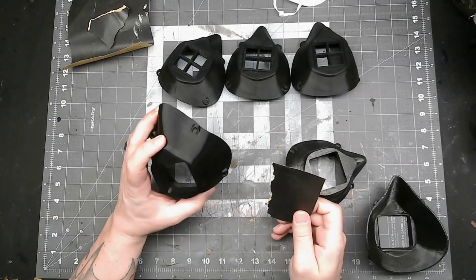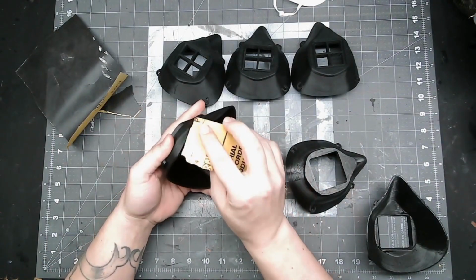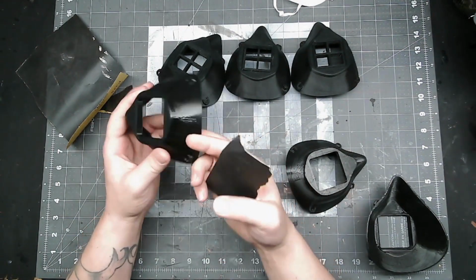So these do require a little bit of cleanup. You're going to want to use some sandpaper, some real fine stuff. This is 320, and you need to sand all around the edge here and on the inside where it touches the face. There is one little thing on these masks right here.